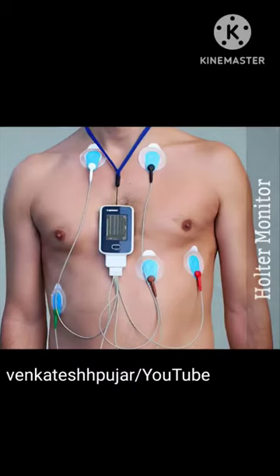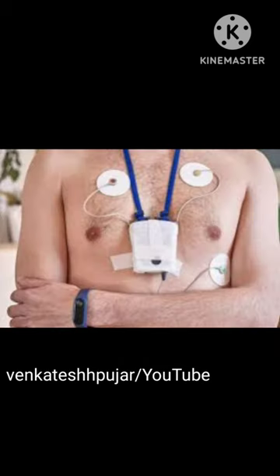In this video I am going to discuss the Holter monitor test. A Holter monitor is a small wearable device that records the heart rhythm. It is used to detect or determine the risk of irregular heartbeat.